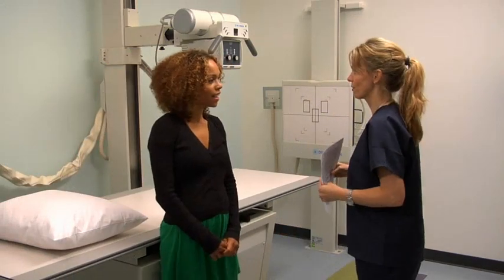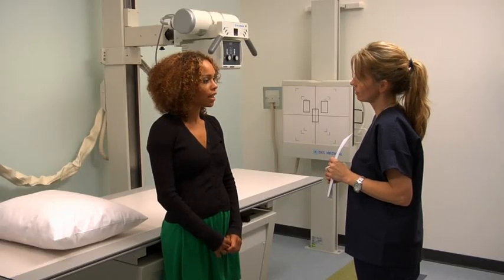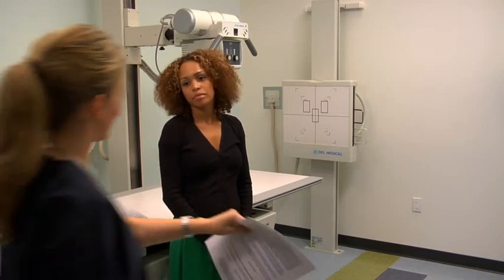Introduce yourself to the patient and confirm the patient's identity. Explain the procedure, patient rights, and confidentiality. Confirm the reason for the examination and obtain a brief medical history. Rule out the possibility of pregnancy in all female patients of childbearing age.